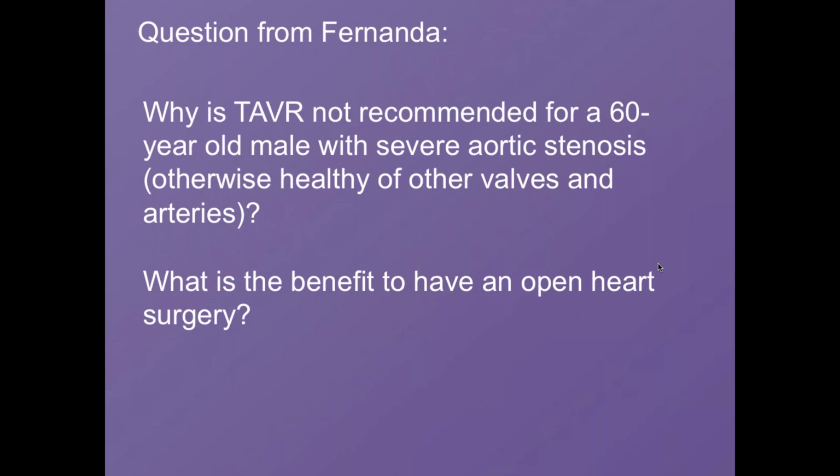But it is an option that, should you need it, should be explored with a good heart team like we have here at Northwestern, where we're really trying to customize the therapy for what's best for the patient. I think something I didn't get a chance to emphasize is that all of the decisions on whether we use a transcatheter approach or open heart surgery with these patients are really decided by the team for what's best for that particular patient. There's not a treatment that's necessarily going to be ideal and applied to everybody. We obviously like to favor the non-invasive or less invasive method, but on the other hand, that may not be the best answer for all patients.